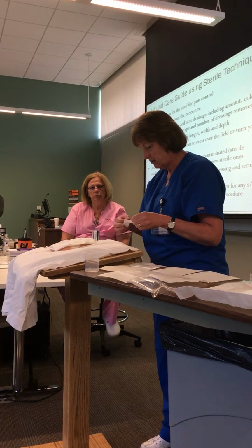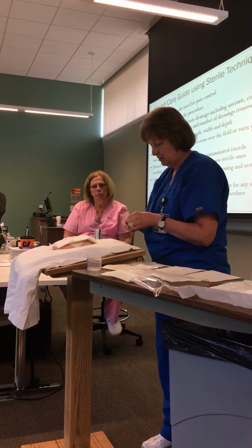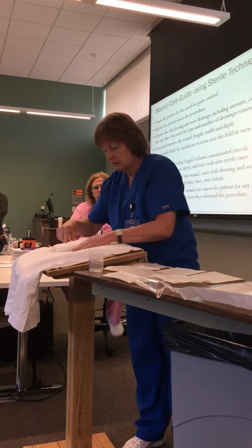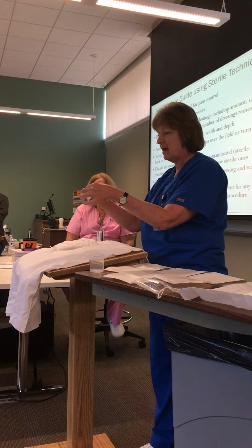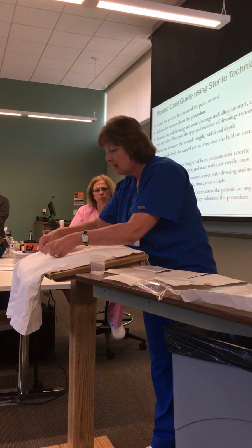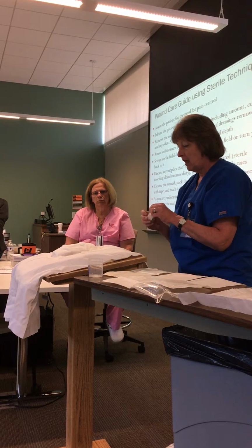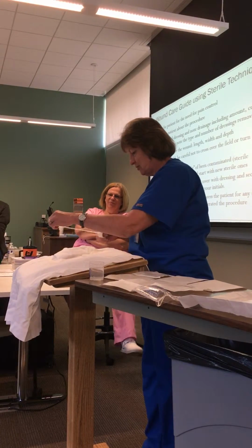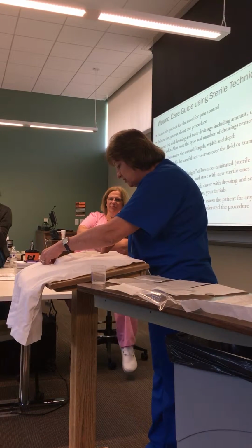What we're going to do is call it a window pane. So we just go around. And because of this example of a wound, I might not get every corner down. And then what I'm doing, you guys, is I'm leaving little tabs at the end. I think there's nothing worse, because what happens is the patients sweat and this paper tape almost like melds to them. And there's nothing worse than a nurse going like this to you. It drives me crazy. And use plenty of tape to make sure that you've got it on there.